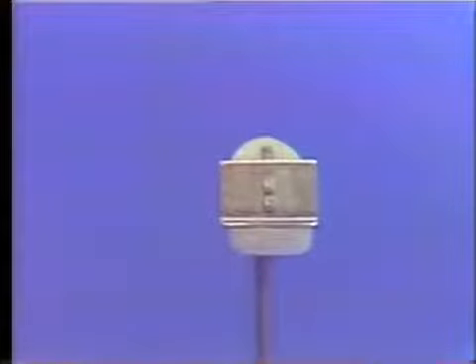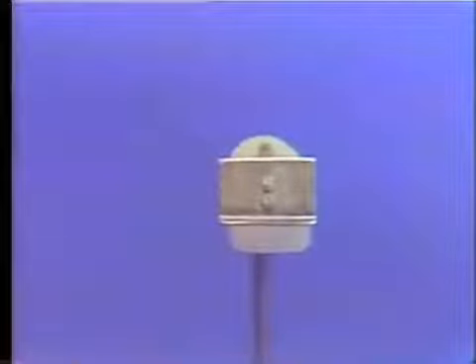It's best, if possible, to use this only in those cases where the functional incisal pathway would lie on the gold backing, so that it would not run across the boundary between the gold and the porcelain biting edge. So in those cases where you've got a marked vertical overlap of the teeth and want translucent incisal edges, this would be an acceptable type of facing to use.